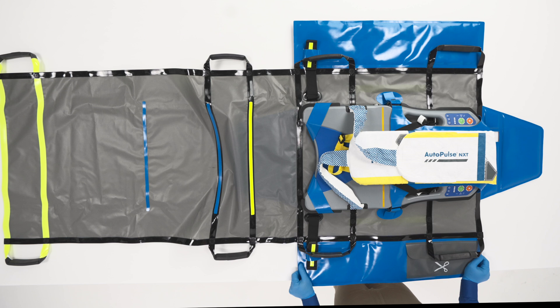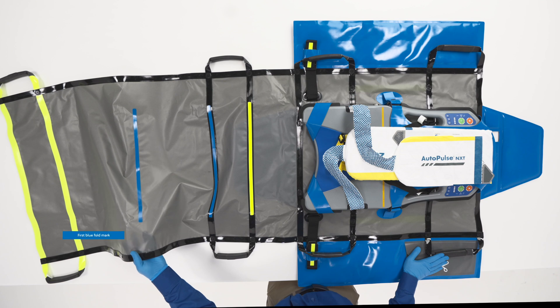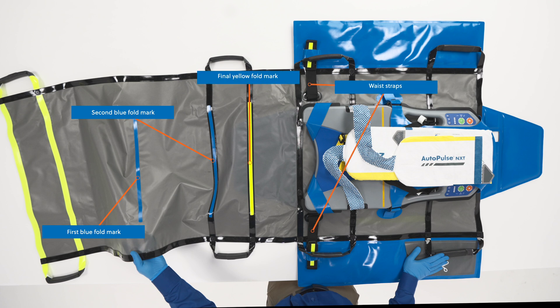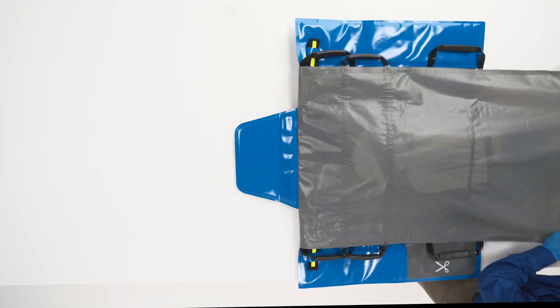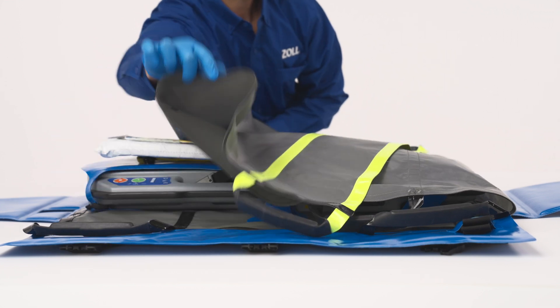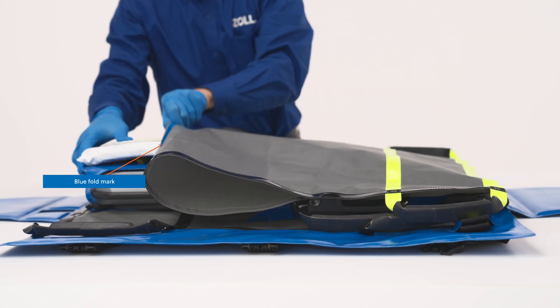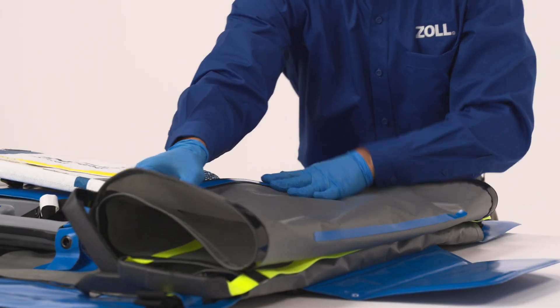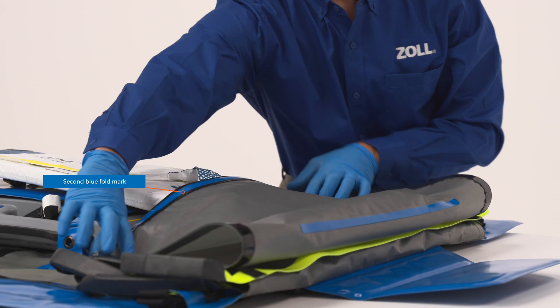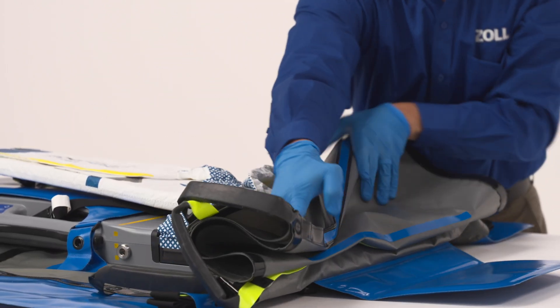Once the platform is attached to the QuickCase Carry Sheet and the shoulder harness and band are secured, the QuickCase Carry Sheet can be folded to secure the system and complete preparation for use. To package the AutoPulse NXT system, pull the gray part of the QuickCase Carry Sheet from the bottom to the top. Fold the QuickCase Carry Sheet in half from the top to the bottom at the first blue fold mark. Then fold the gray part in half one last time from the top to the bottom at the final yellow fold mark.